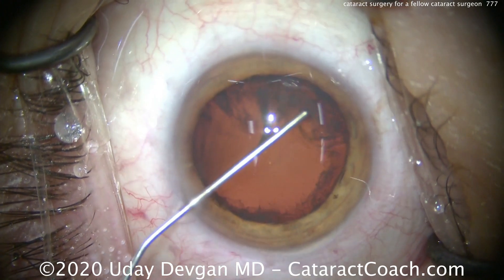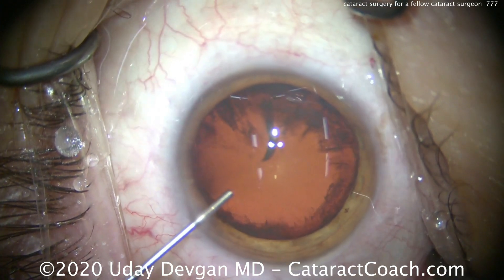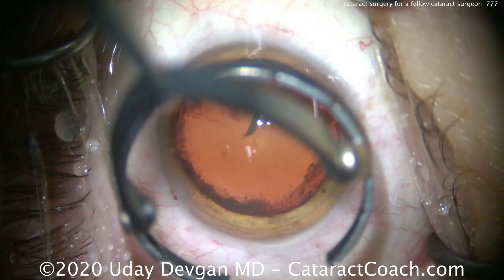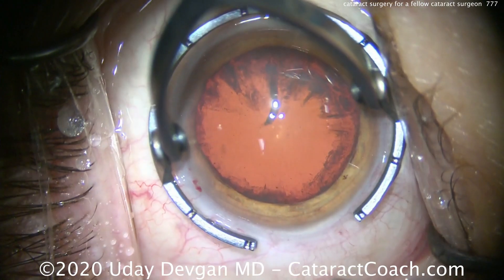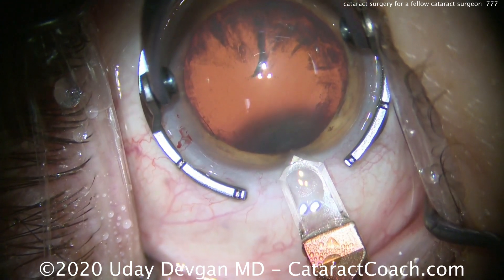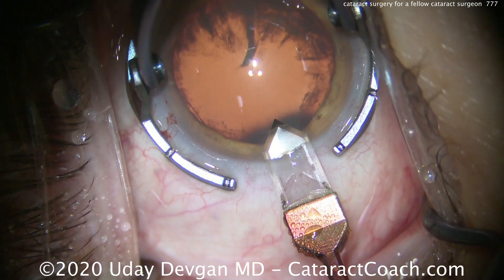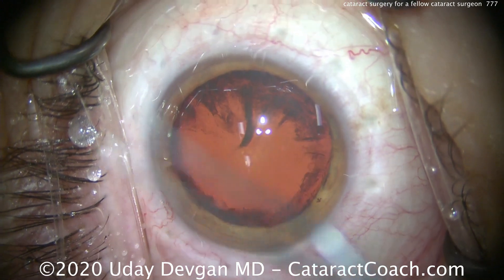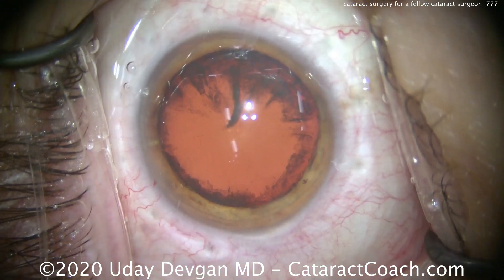We just put some anesthetic in the eye. Now we're going to fill the anterior chamber with our dispersive viscoelastic to protect that cornea. Here comes the main incision. The surgeon has a little bit of steep astigmatism, against the rule. We'll use a 2.75 diamond keratome to make a very nice phaco incision. That looks great.